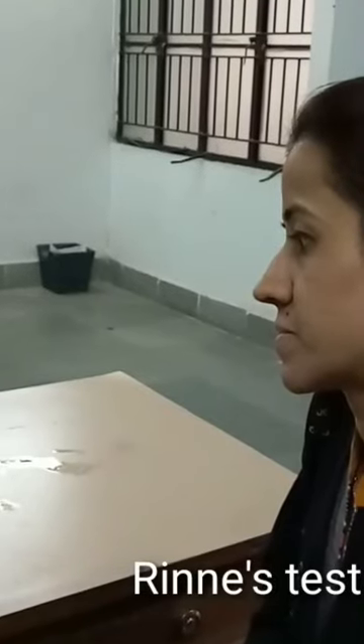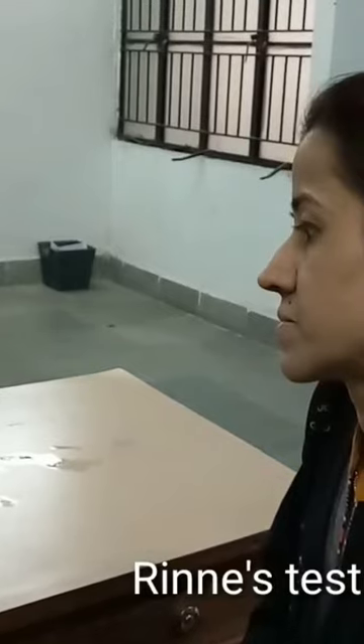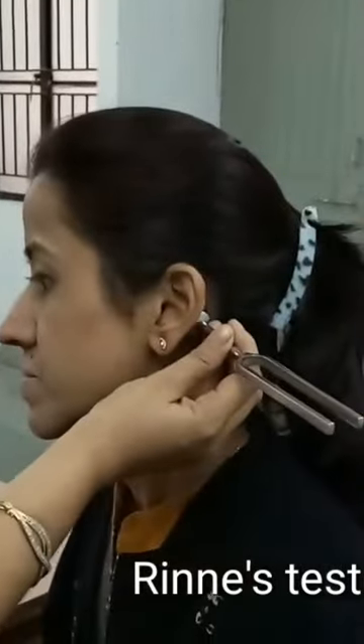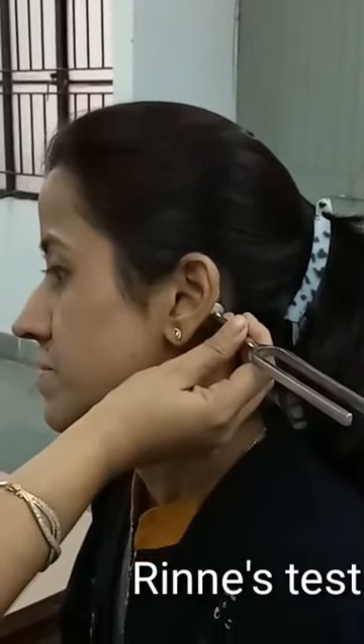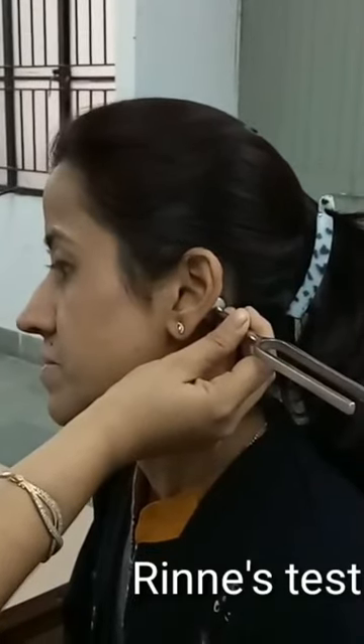Make the tuning fork vibrate by suddenly stroking the blades of the fork against a rubber pad, and place it on the mastoid process of the subject. Ask the subject to raise the finger when he or she stops hearing the vibrations.